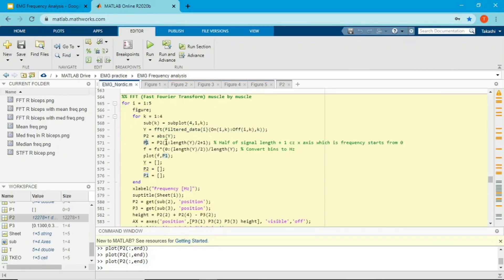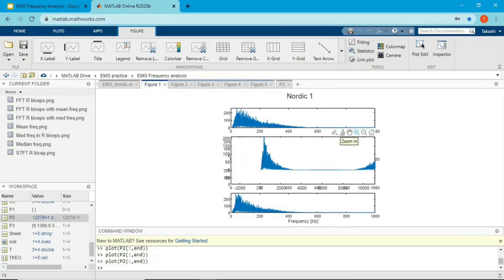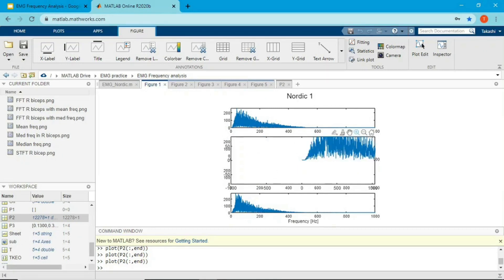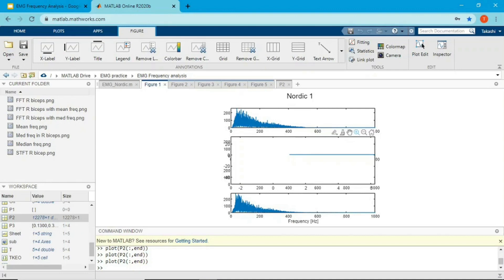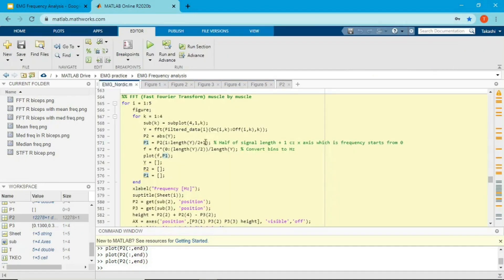Line P1 creates the single-sided FFT by taking half of P2 — specifying data from index 1 to half the length divided by 2, plus 1, because frequency data starts from 1 but frequency should start from 0. That's why I extract one extra value. When I define the x-axis using this formula, I'll have matching dimensions for x and y axes.